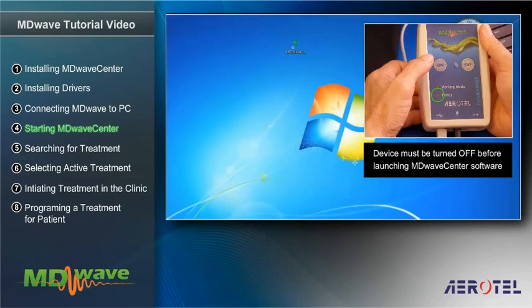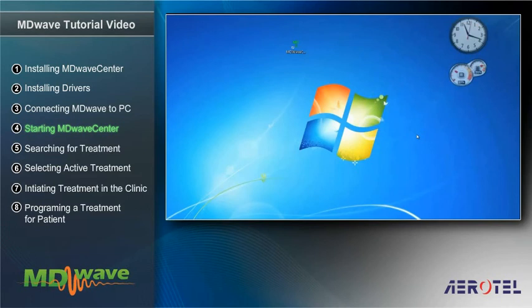Check that the device is turned off. A green MDWaveCenter icon will appear on the computer's desktop. Double-click the icon to activate the program.